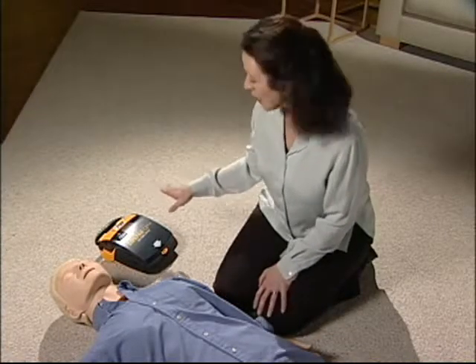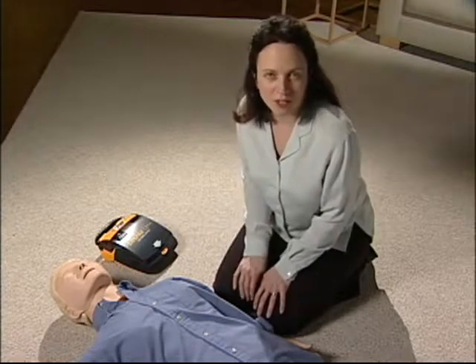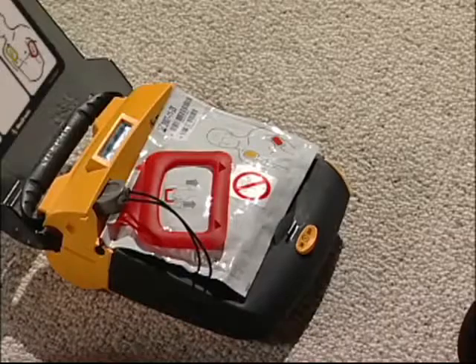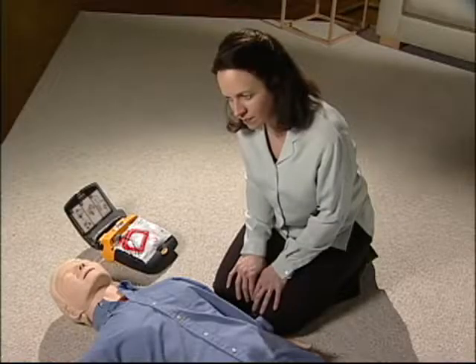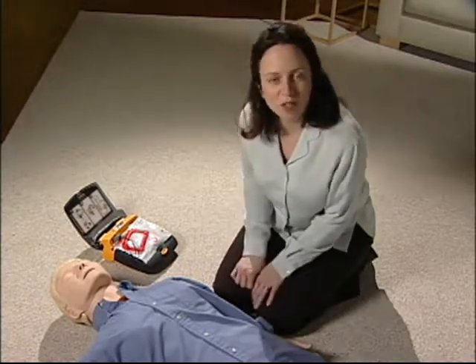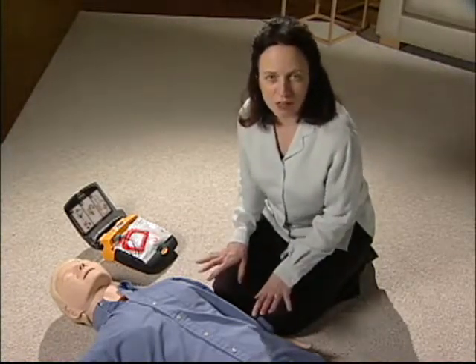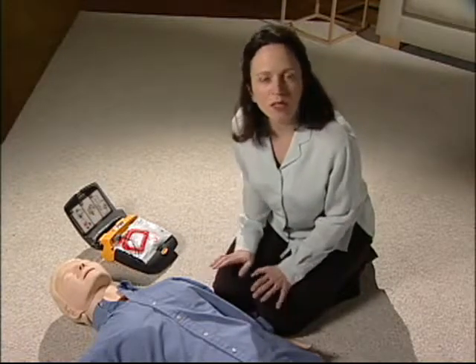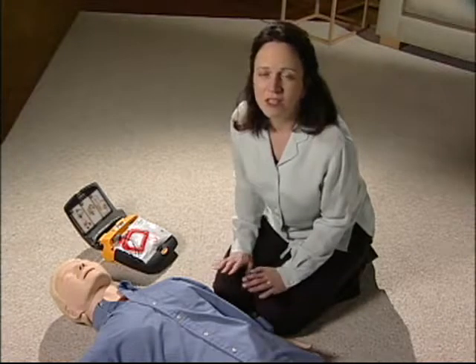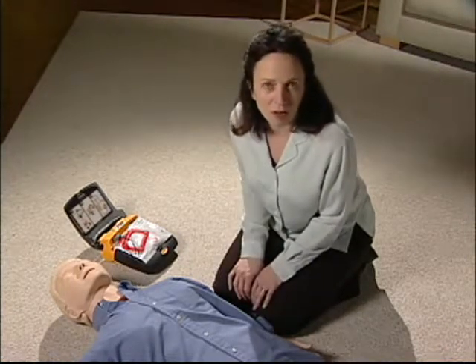Set the Lifepak AED on the same side of the patient as you. Press the on-off button. Call for help now. Remove all clothing from patient's chest. You've already called 911, so start getting the clothes off their chest. Do whatever you have to do to clear the clothing quickly. Lift it, tear it, or cut it off. Don't waste time being nice to the clothes.